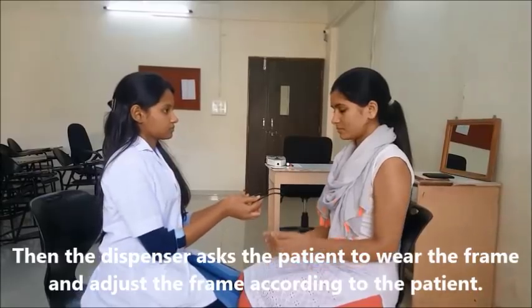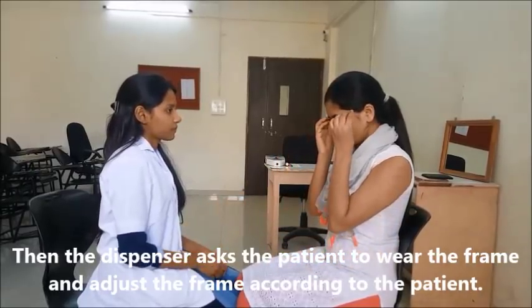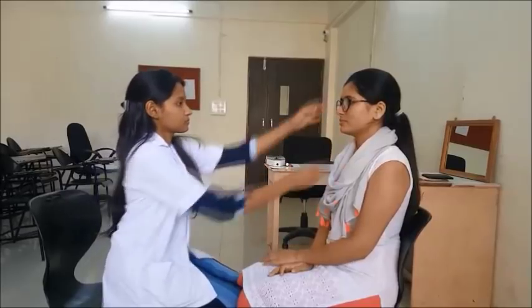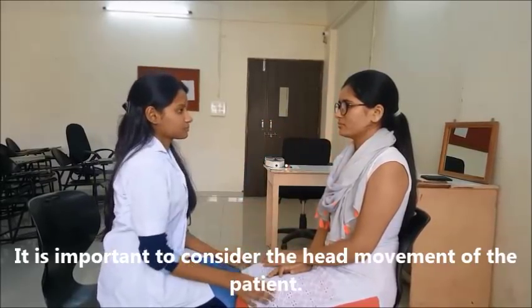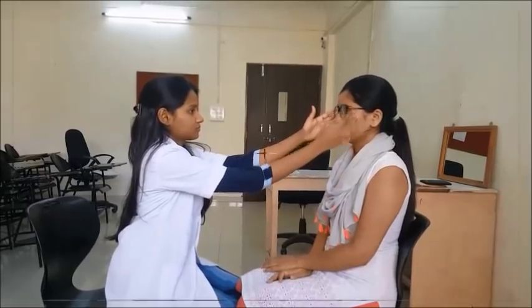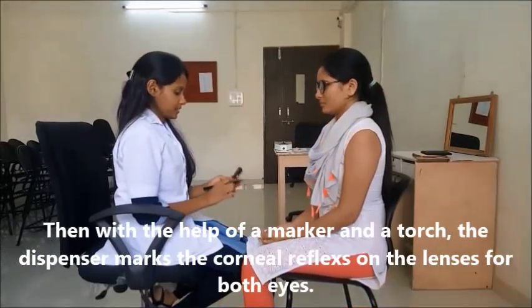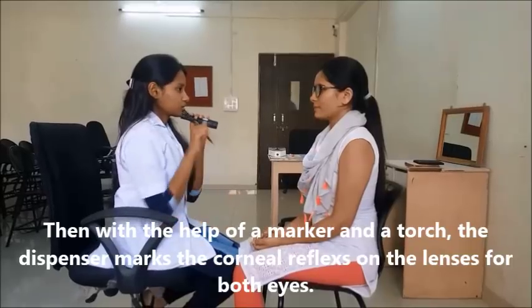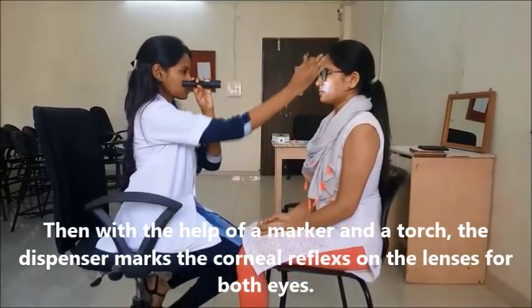Then the dispenser asks the patient to wear the frame and adjusts it according to the patient. It is important to consider the head movement of the patient. Then with the help of the marker and torch, the dispenser marks the corneal reflexes on the lenses for both eyes.